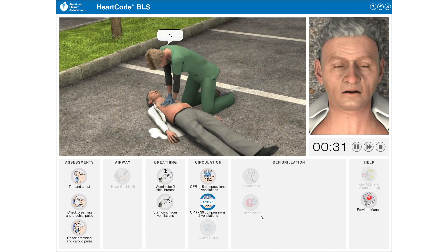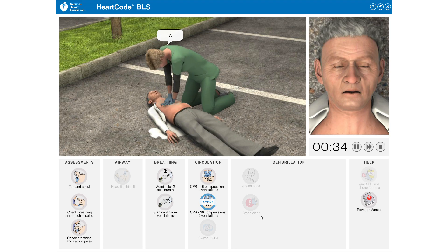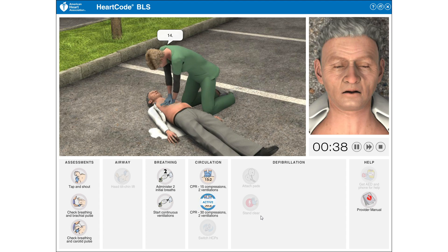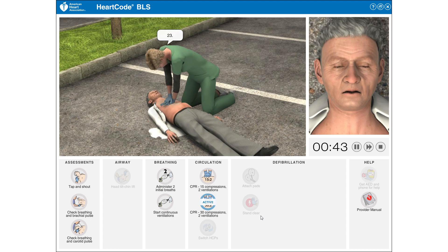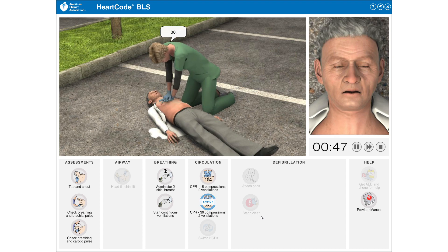1, 2, 3, 4, 5, 6, 7, 8, 9, 10, 11, 12, 13, 14, 15, 16, 17, 18, 19, 20, 21, 22, 23, 24, 25, 26, 27, 28, 29, 30.